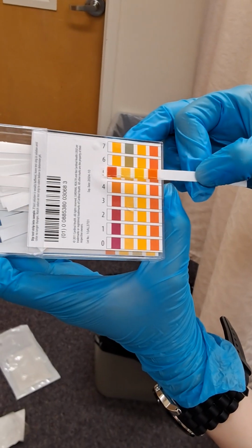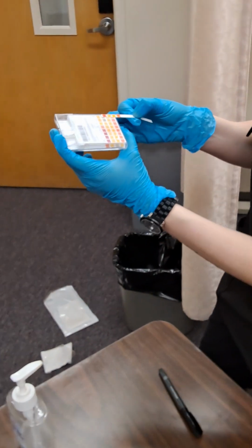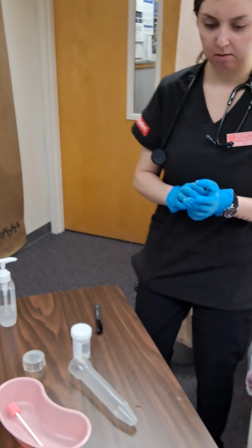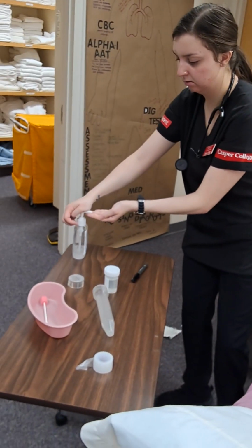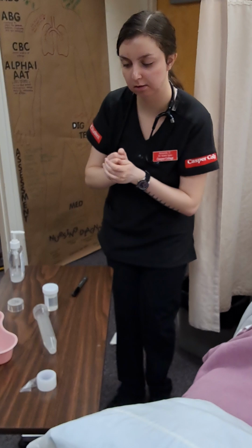So his pH is a 4, so that's an indication that we are in the stomach. I'm going to throw that away. I'm going to take off my gloves, sanitize my hands. Okay, this is when I will call to get an x-ray appointment.